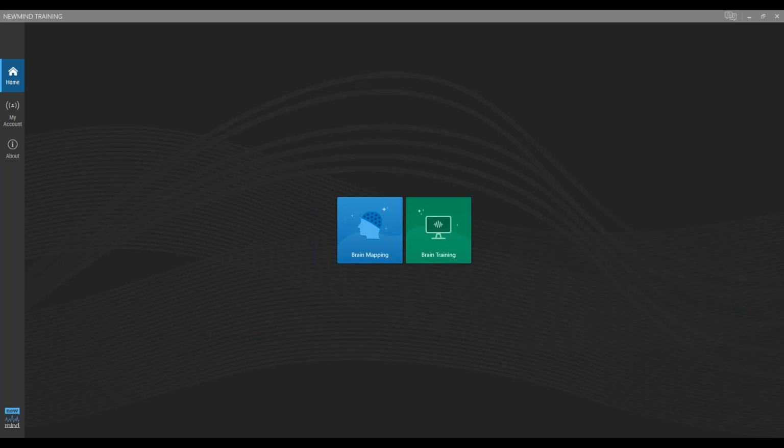I mean, with the new mind software, I would do my best to try to figure out what's going on, but we all know we get those clients that, for whatever reason, their muscular system, something's going on that we just get constant issues either on one side or both.